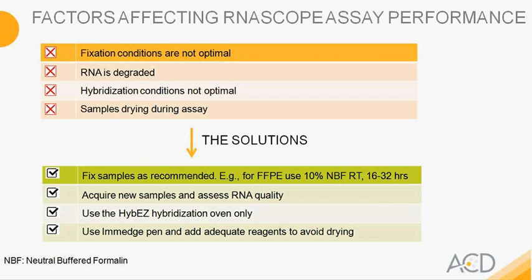If your samples are drying during the assay, it's perhaps due to workflow issues. If you're observing workflow issues, please review our protocols for drying samples and adding reagents. The other factor that causes drying is the use of different hydrophobic barrier pens.